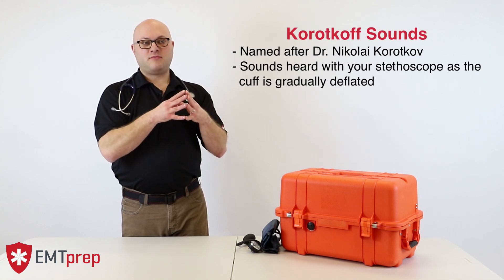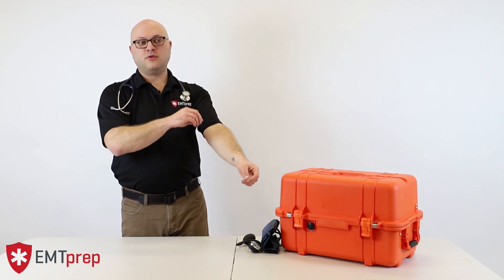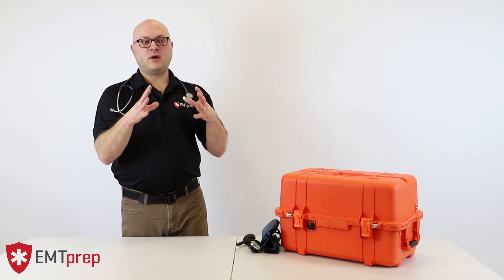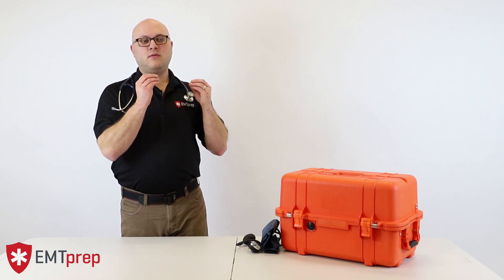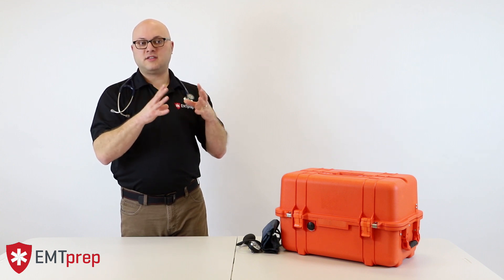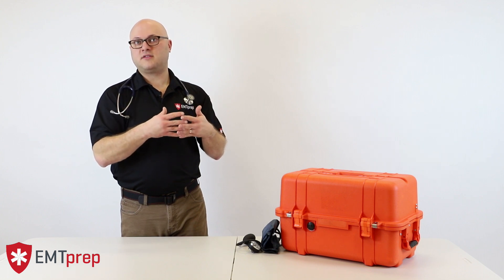As we continue to reduce cuff pressure, blood flow will continue to pulse by the obstruction presented by the cuff until the cuff pressure is lower than the diastolic pressure. Once the cuff pressure drops below diastolic pressure, the blood will flow laminarly. There will be no impediment to blood flow during either systole or diastole, so we will no longer hear any sound, as there is no turbulence to make the blood bounce off the artery walls.